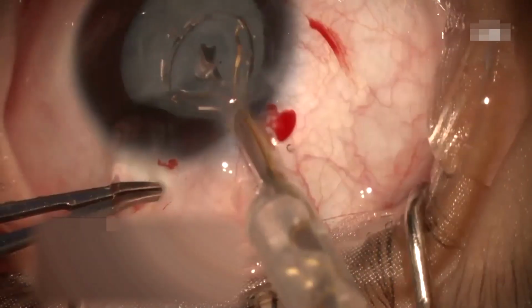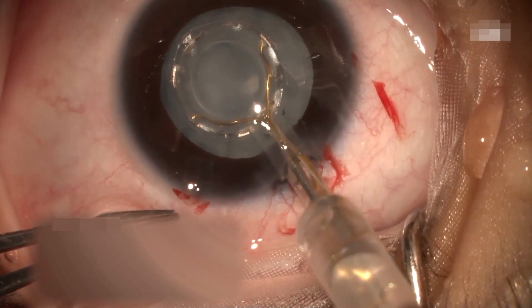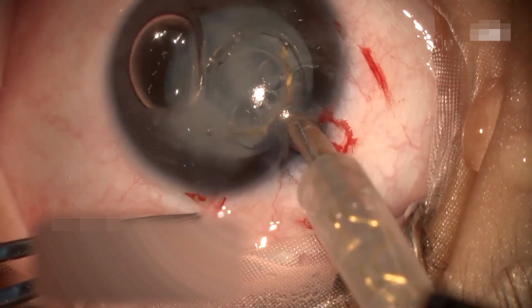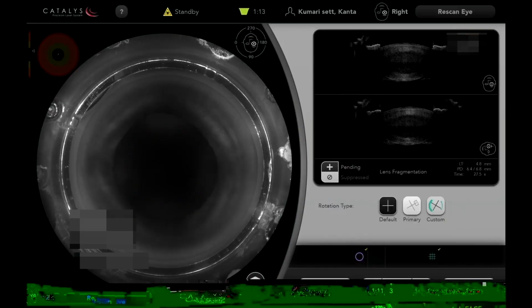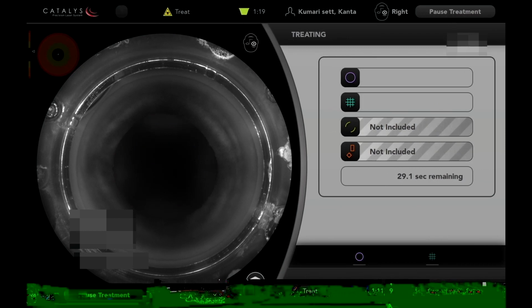This technique can be used as an alternative to manual capsulotomy in children and has the added advantage of resulting in a capsulorhexis which is round, well-centered, strong, and also has an easier learning curve. Although not frequently used in pediatric cataract, femtosecond laser-assisted anterior capsulotomy is another option which provides precise, accurate, and strong capsulotomy. A separate laser platform may not be feasible in children as pediatric cataract surgery is done under general anesthesia.